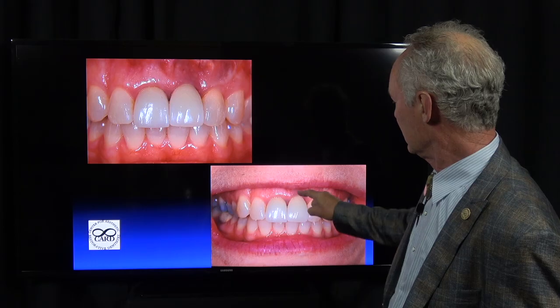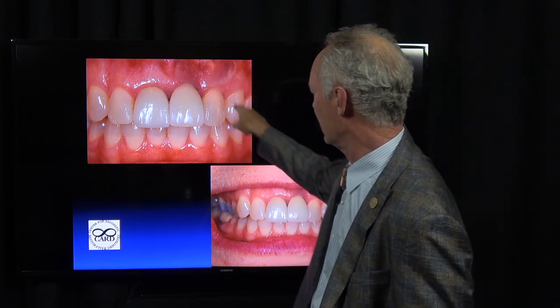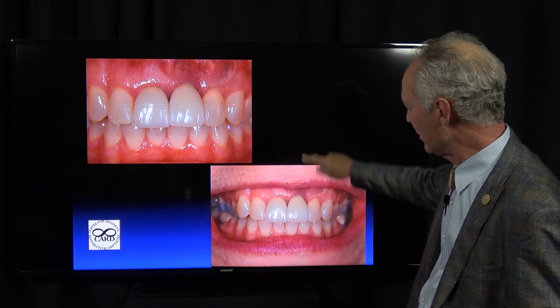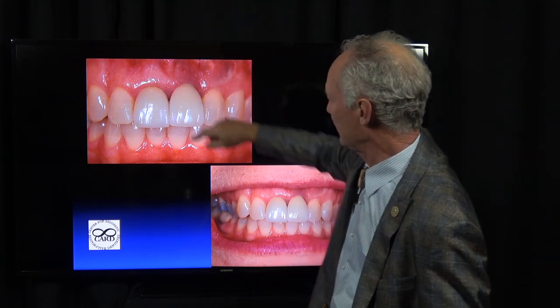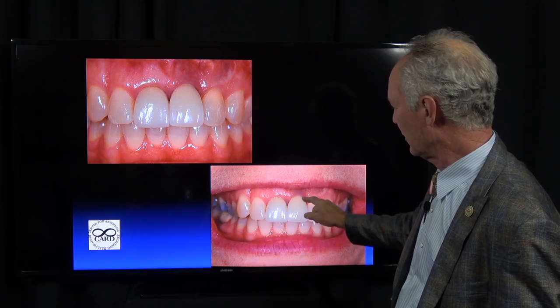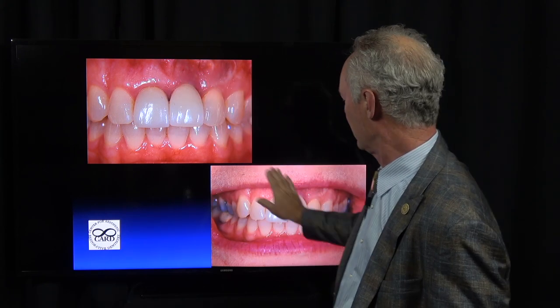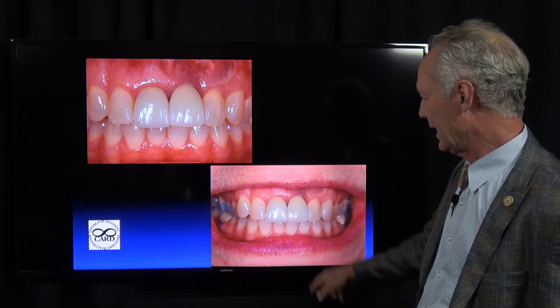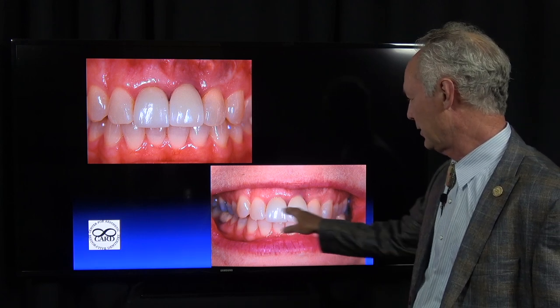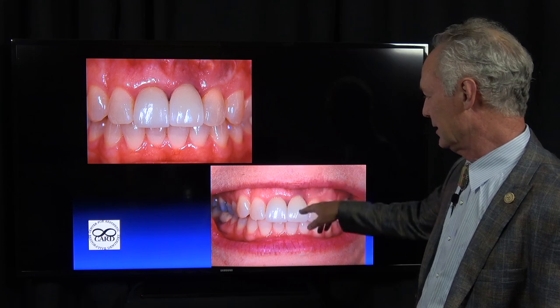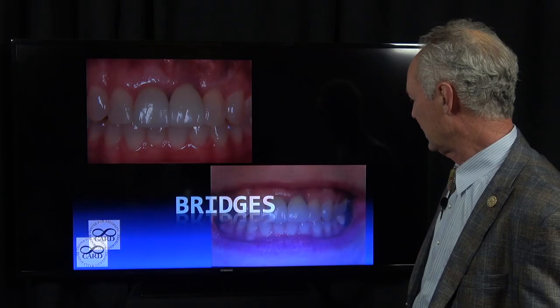Now this is another case. You can see the implant was placed here and the implant looks good, the gum line looks good. The only issue is she's got a high lip line — all bets are off when the patient has a high lip line. This bone is very thin right here, and the tissue is not very thick. So if it's a titanium implant, which most of them are — zirconium implants have just been invented — that implant may shadow through the bone and the gum, and if the patient has a high lip line they don't like it. This person was happy with the crowns. I didn't do this case — she came in as a new patient — and it's not easy to remove an implant, so you have to take those things into consideration.